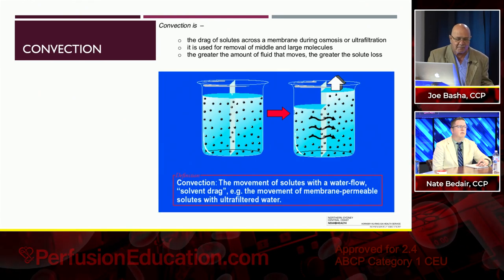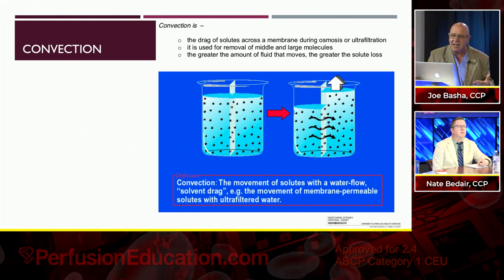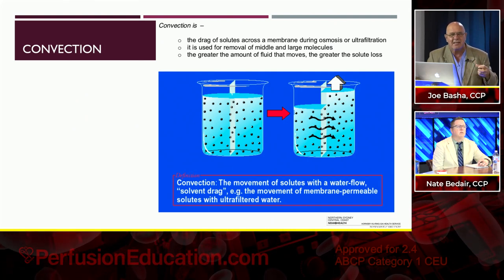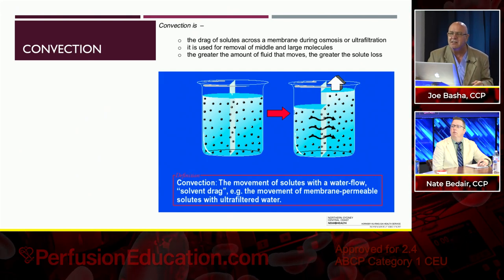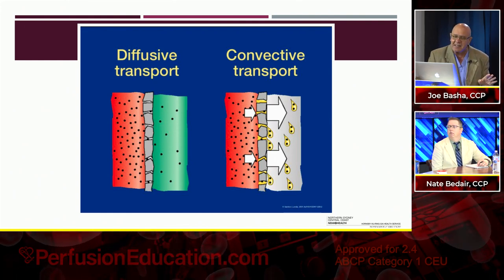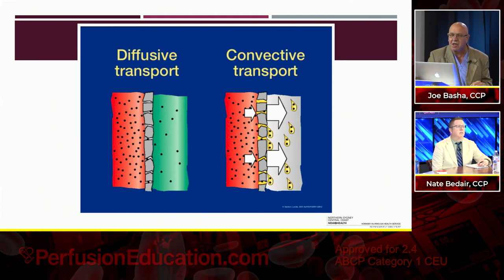We talked about convection, which is when you use a hydrostatic force like that and are pushing or pulling, forcing clumps of water across, and it's able to draw larger molecules across the pore size. Because theoretically, if the pore size is big enough, the molecule should be able to go through, but that isn't really the case because you have a sieving coefficient, which I'm going to very briefly talk about again.